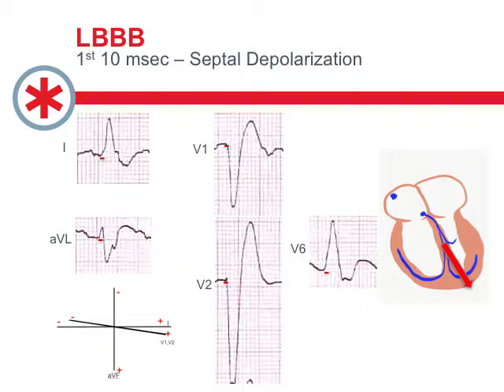The septum activates and the right ventricle activates, but the septum is a much thicker structure than the right ventricle, which is very thin-walled. So a lot more of your current flow is going to happen in the interventricular septum, and that drags the mean electrical flow a bit to the left, as demonstrated by the red arrow on that beautifully drawn heart.